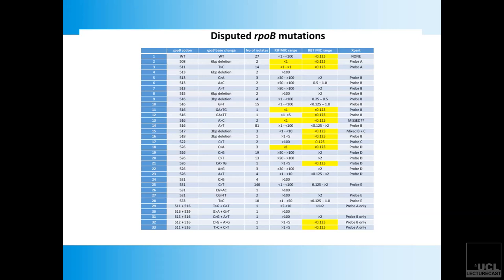no problem. Very good. So the line probe assay, which part can we do? So the line probe assay, what you basically have is that you do a PCR across those drug resistance defining genes for rifampicin and INH. And then you have got a strip where you put a probe, where you've got oligos impregnated onto the strips.